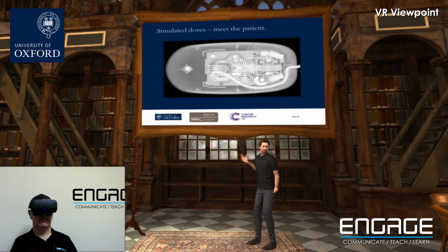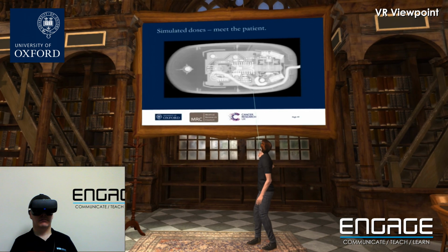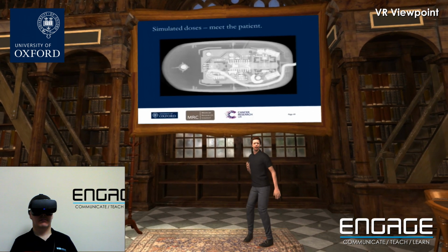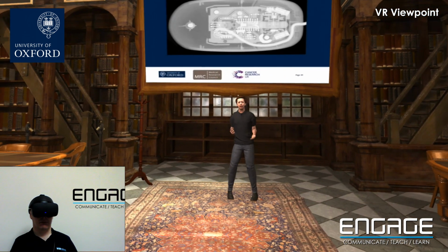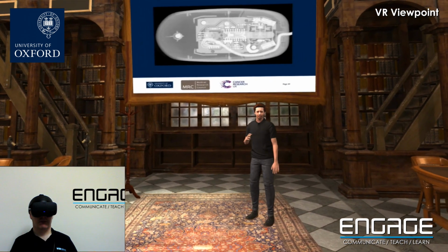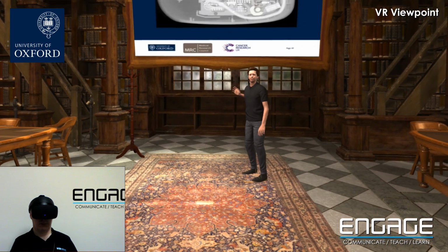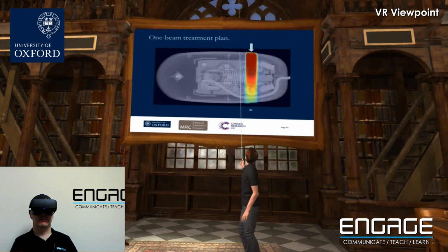Or mice even, I suppose. And so what we're going to do is pretend that this little semicircle here is a tumor. And I'm going to ask the computer to simulate what happens if I shine billions of photons. We're going to do this Monte Carlo modeling and ask what happens if I send a beam in there to knock out that tumor. So here's a beam, it's coming from the top.